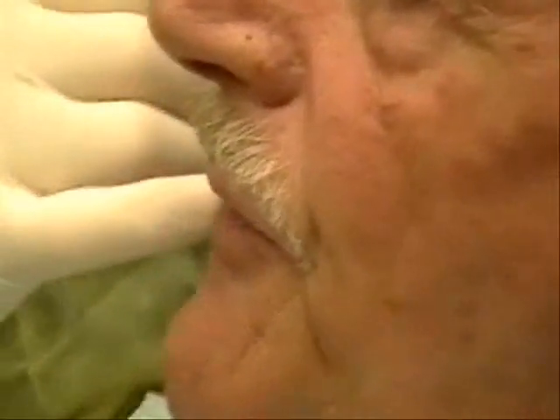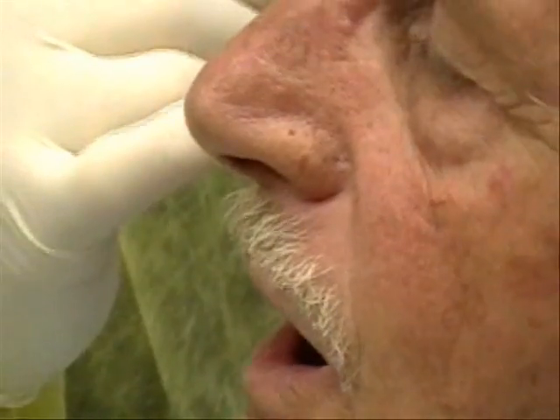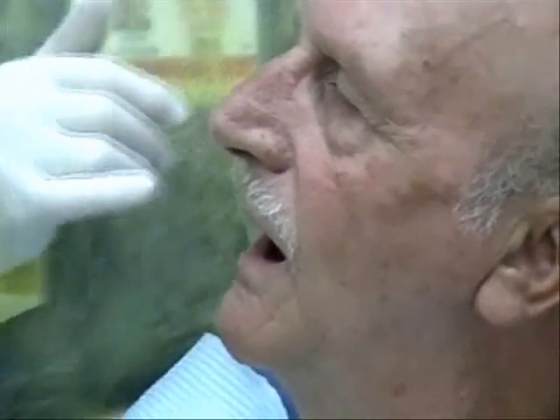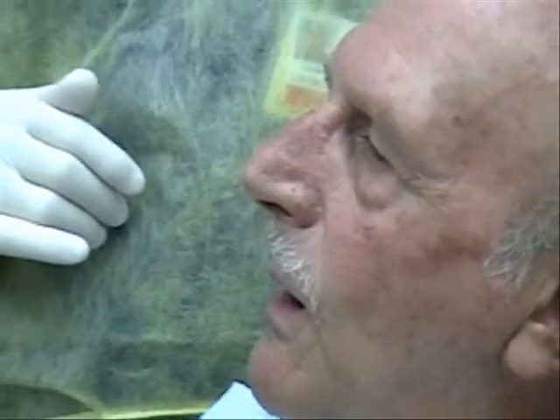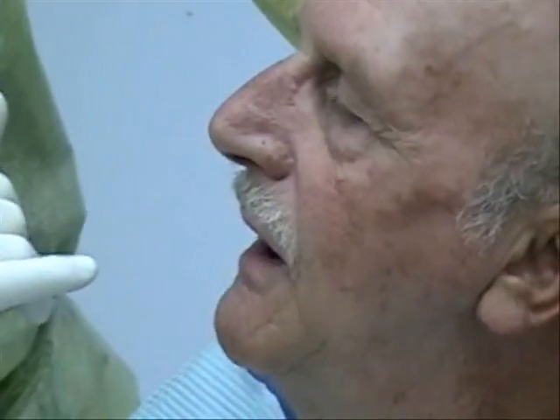Have him do it again so we can see that — nice and slow. Fifty-five. Say fifty-five. Fifty-five. That's right on the wet line. Well then we'll leave it alone. That's right on the wet line — we'll call that good. Fifty-five.